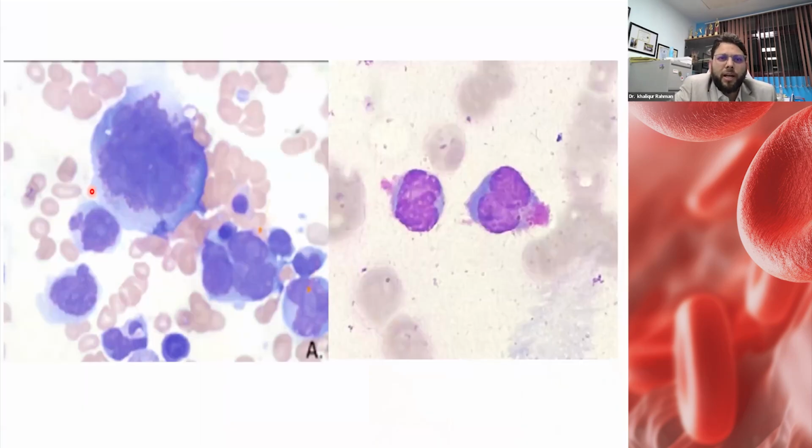You can have very large, coalesced plasma cells looking like megakaryocytes. Sometimes you can have plasma cells with a figure of 8 and prominent reddish granules, suspicious of APML. So all these are the morphological spectrum, and when you scroll a lot, you find certain features that help you define that these are plasma cells and not something else. But there are certain situations where you have to rely on IHC or flow cytometric immunophenotyping to say that these are plasma cells. So they can be of varied morphology.